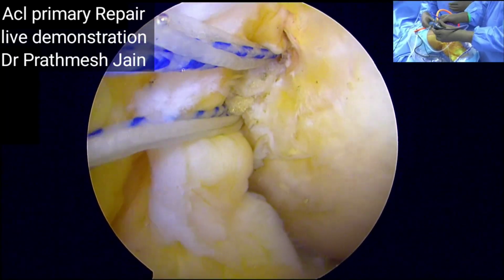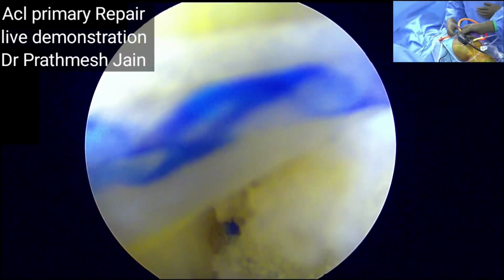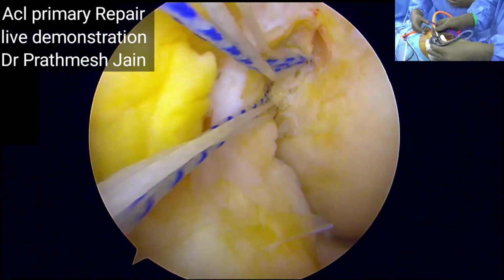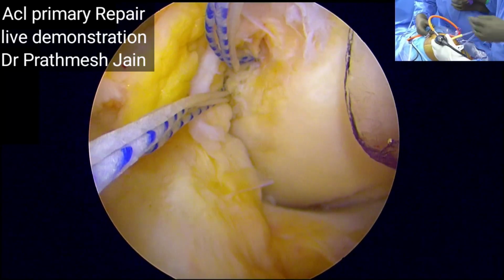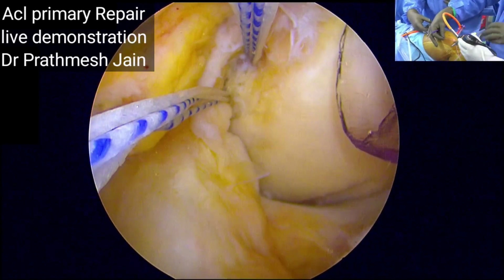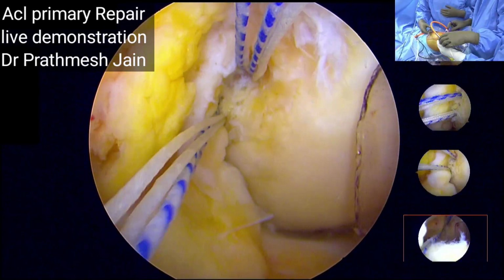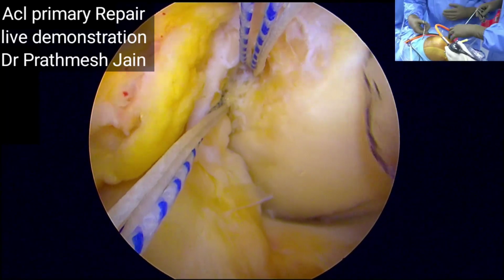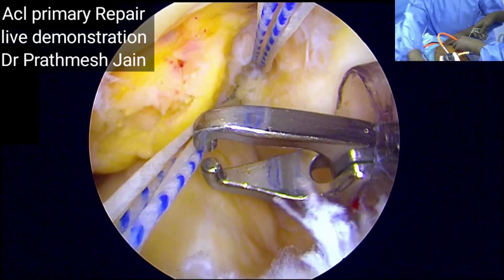So what you can appreciate is now we have shifted it up and we are holding the scope in the medial portal. The upper anchor you can see very well, the lower anchor you can see very well, and there is a cannula which is coming from the lateral side. Green retriever please. And at this point of time, just remove the lower cannula please.